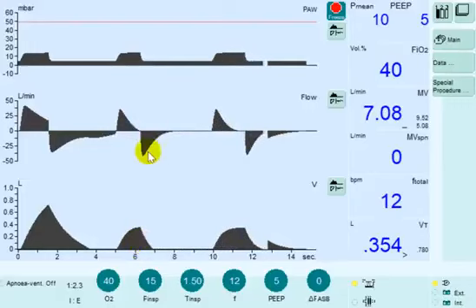However, the lung is very stiff and it empties very fast. You can see the peak expiratory flow is increased compared to the previous breath, and the lung can exhale much faster.